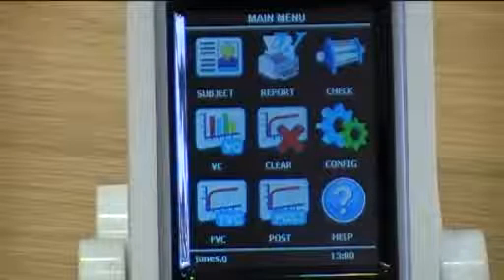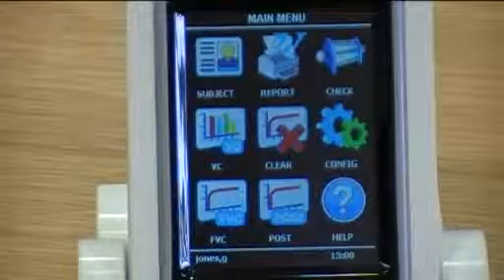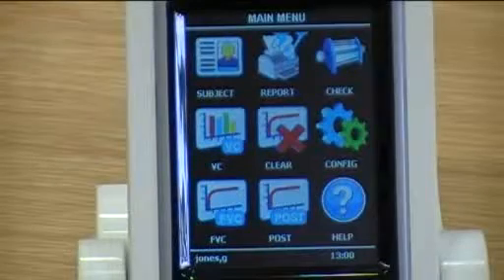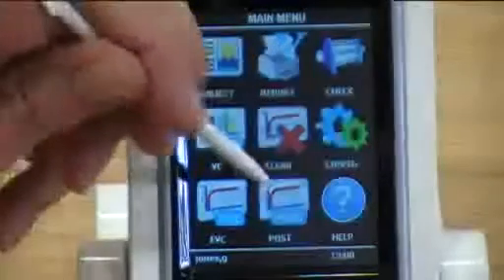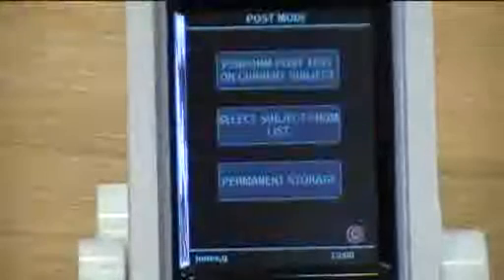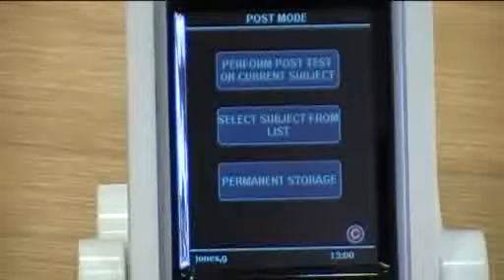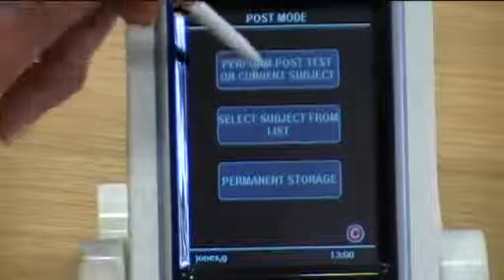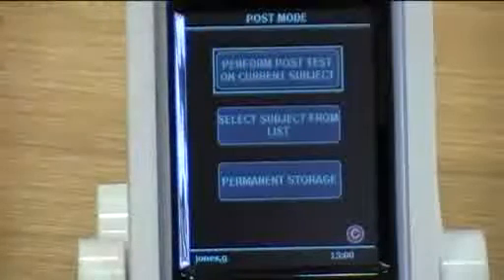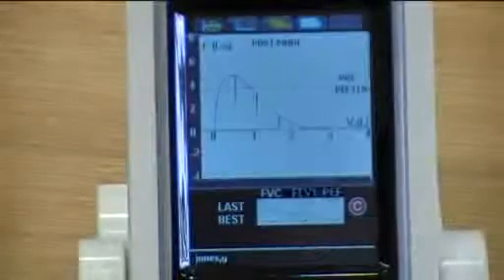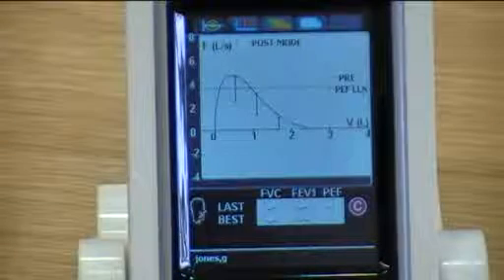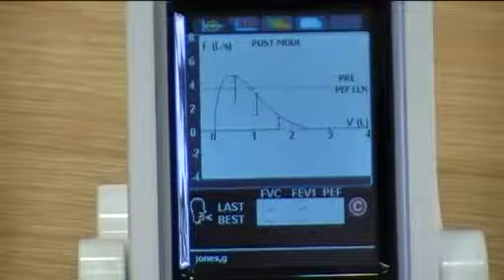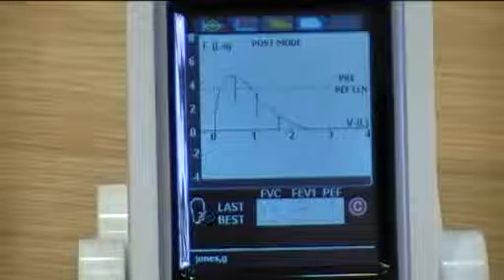The Intuitive can also test for reversibility of airway obstruction by selecting the post icon. Select the post icon, and perform the post test on the current subject. Select. And now you can perform your post mode and do reversibility testing.